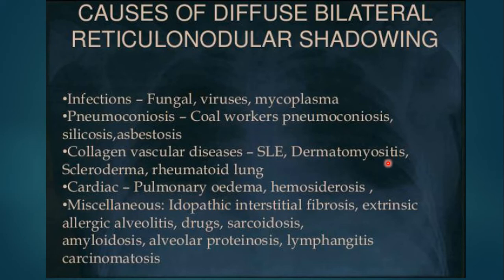Each one of these multiple causes of reticular and reticulonodular pattern has its own findings, its own distribution.